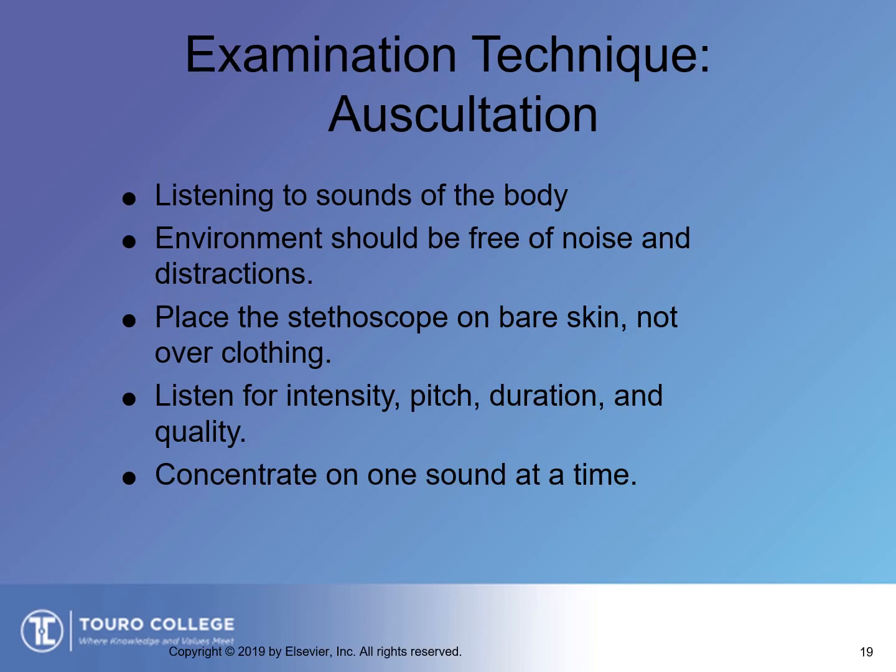Different techniques of listening to the sounds of the body. Place the stethoscope on bare skin, not over clothing. I see, oh my gosh, it makes me cringe when I see providers do that. You are not gathering a clear picture of what's going on if you're listening over a shirt.